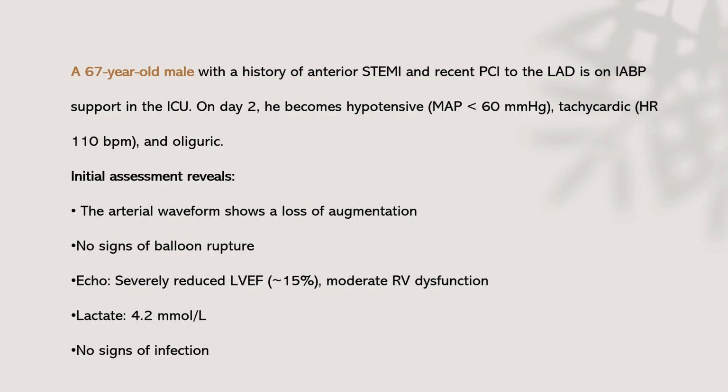On assessment, we found the arterial waveform shows loss of augmentation, with no sign of balloon rupture. Echo showed a reduced left ventricular ejection fraction of about 15% and moderate RV dysfunction. The lactate level is 4.2 mmol, and there is no sign of infection.